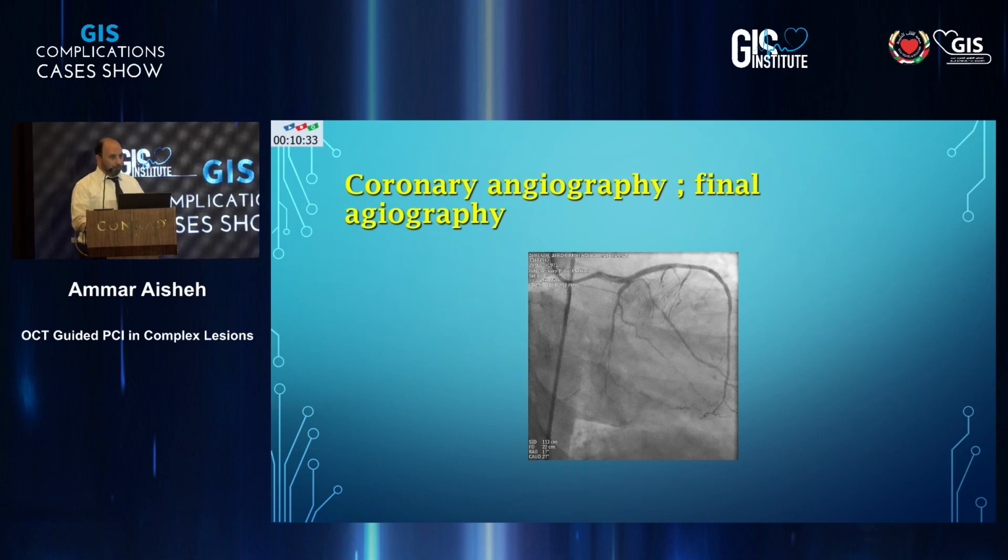Just as you touched on now, Dr. Mohanad, that area, especially the area where the LIMA will come in the future, I prefer to avoid metal in that area. Whatever you do, avoid putting metal there, and treating with DCB these days is better, especially in patients with multivessel disease.